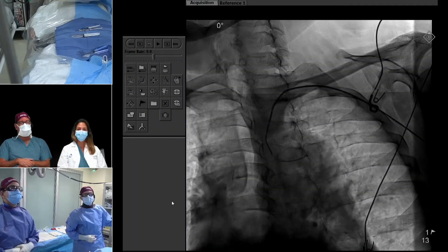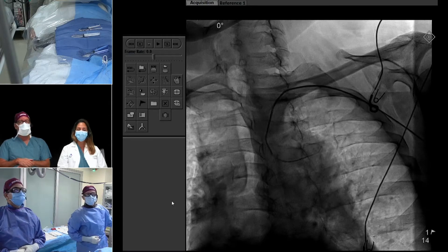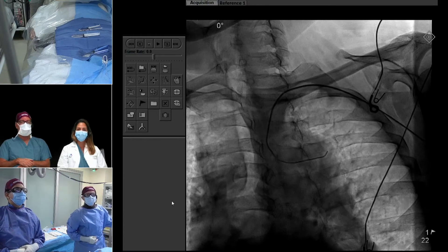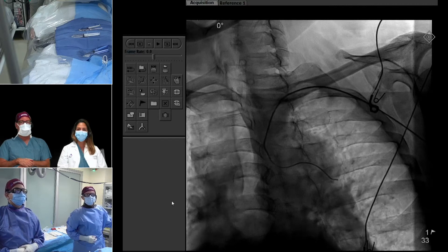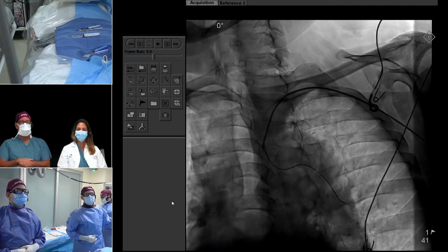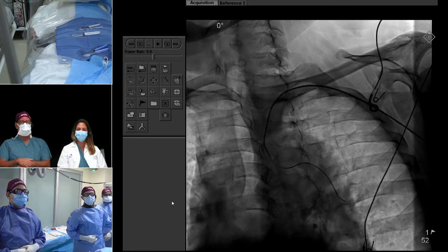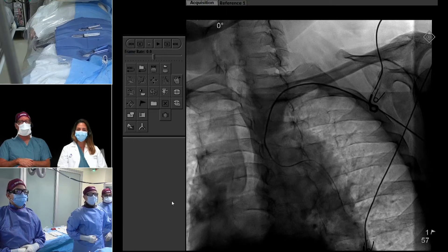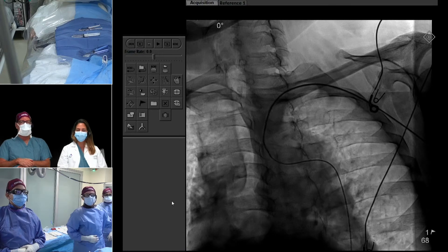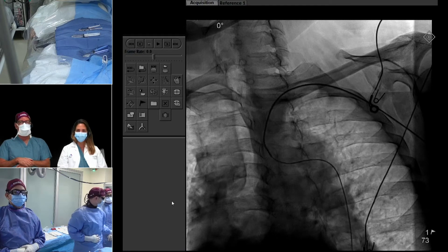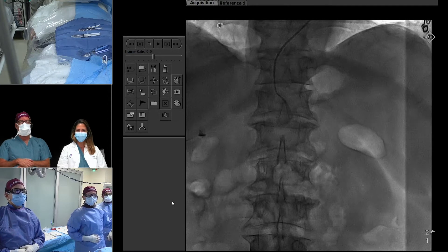At this point, navigating the arch — this patient does have a fair amount of tortuosity in the arch. We were able to pass the Sarah down fairly easily. Selecting the celiac while dealing with the tortuosity was a bit difficult. We ended up using the microcatheter from the aorta through our guide cath, our JR4 that we have down.